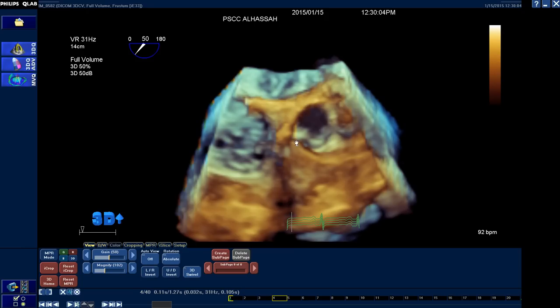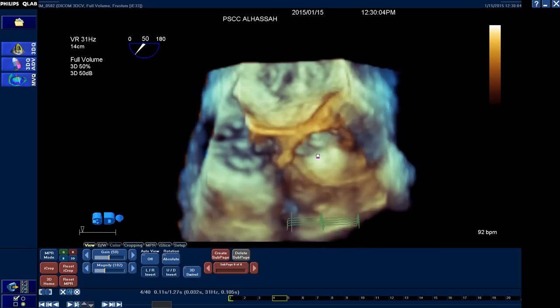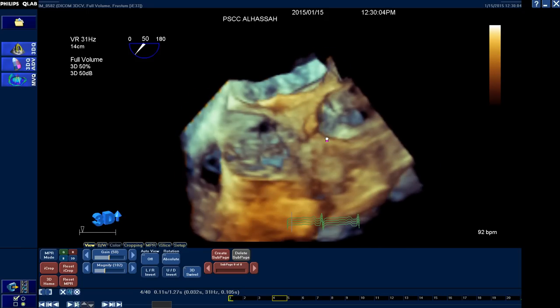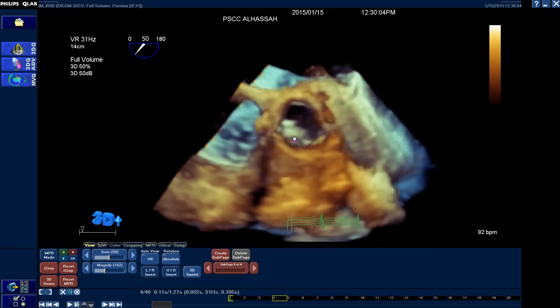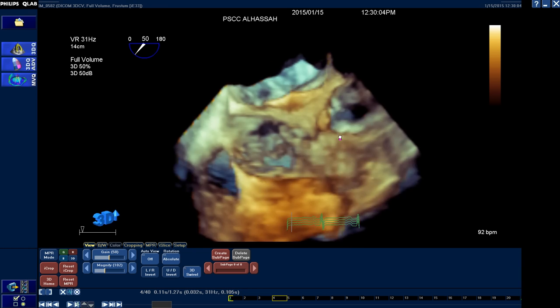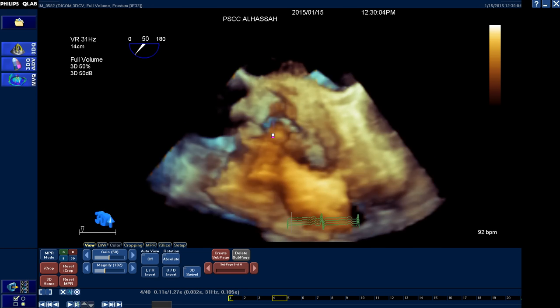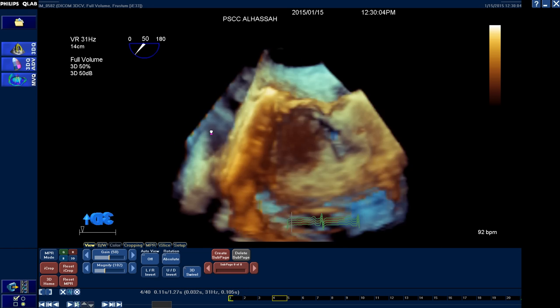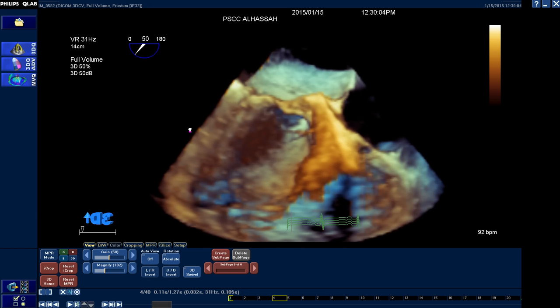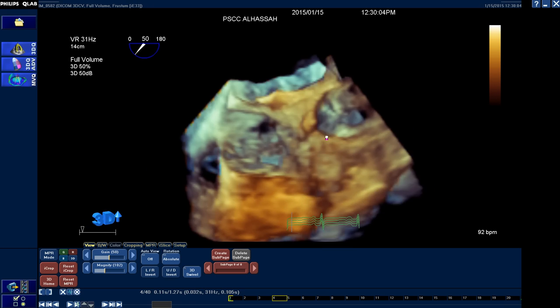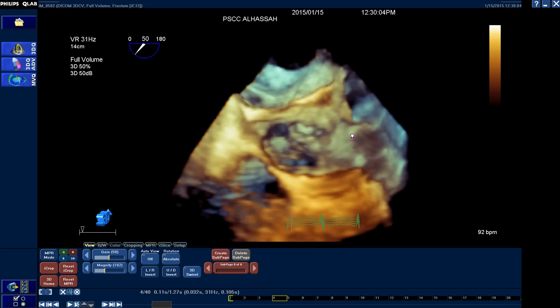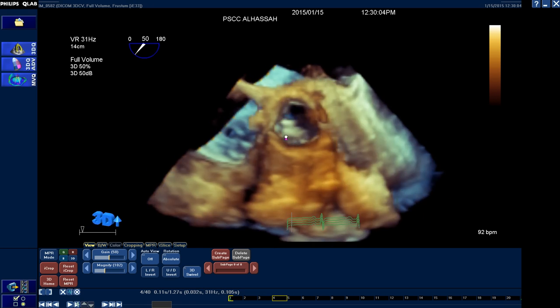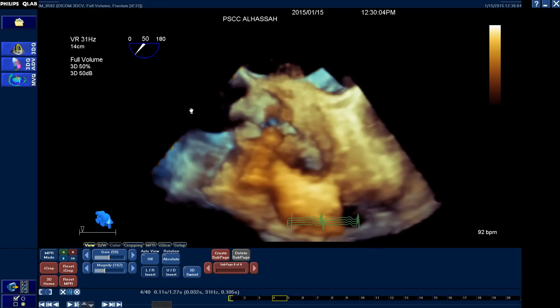Using this volume, as you can see, it can be taken by 3D zoom or by full volume, including the aortic root and part of the ascending aorta, in order to get the full dimensions we want. We will start by clicking 3D quantification.